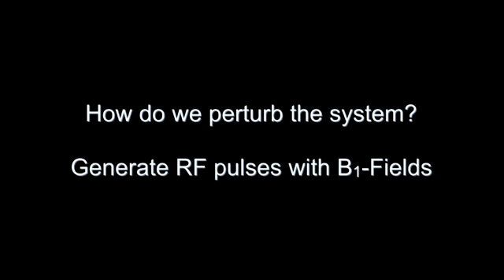Okay, so what we ended with at the end of last lecture was really a kind of stable system, right? We said we have some bulk magnetization. If you remember, we forced that magnetization to have a particular orientation and said, there's no relaxation, let's just observe what happens. We ended up getting a sinusoidal variation of the X magnetization and a cosinusoidal time variation of the Y magnetization. And the Z magnetization was stable because we didn't have any relaxation terms in there.